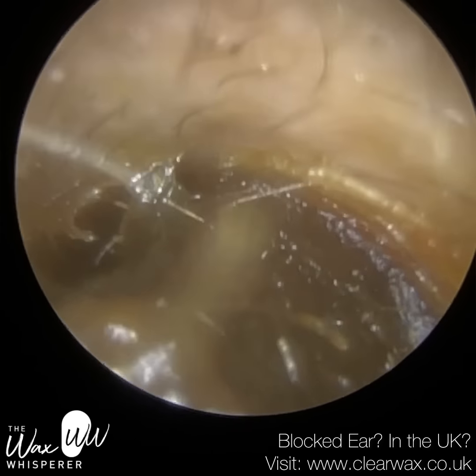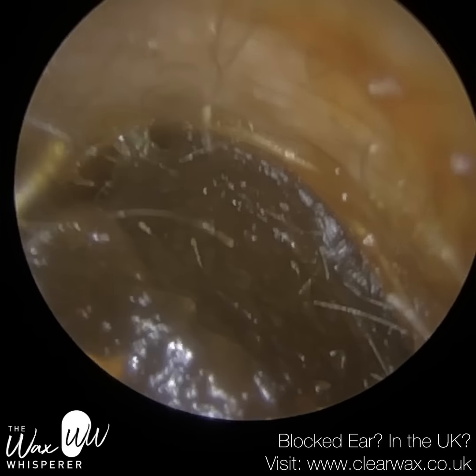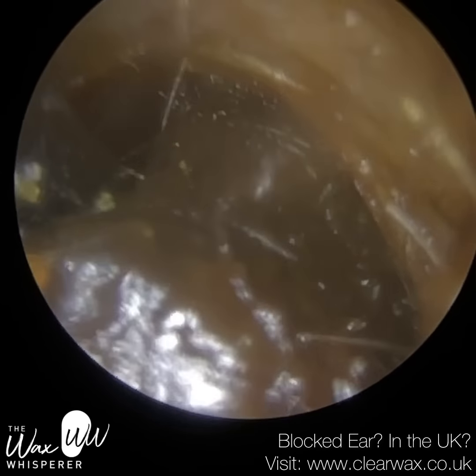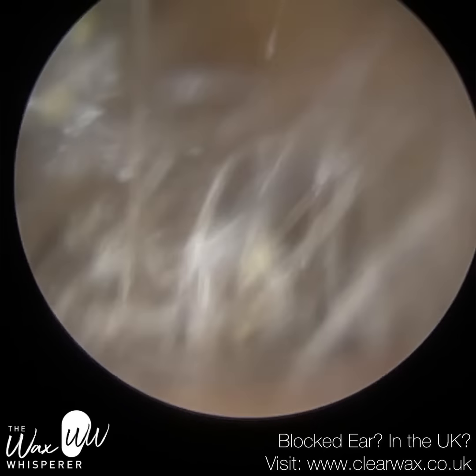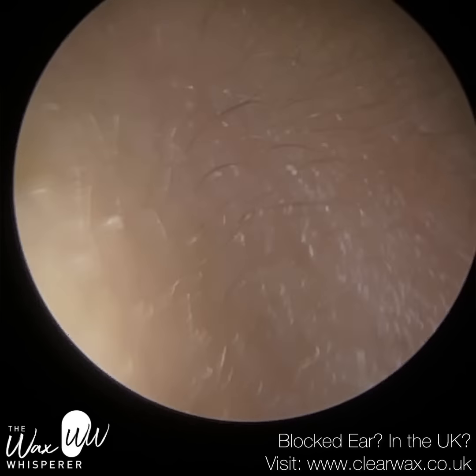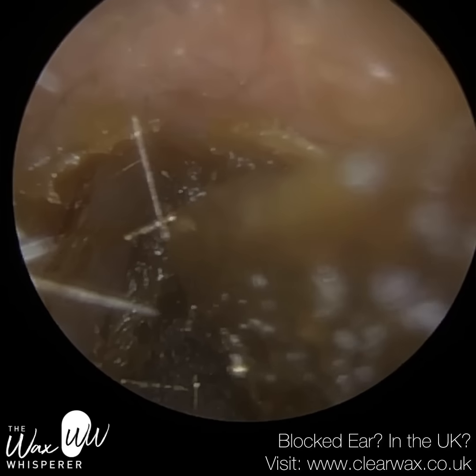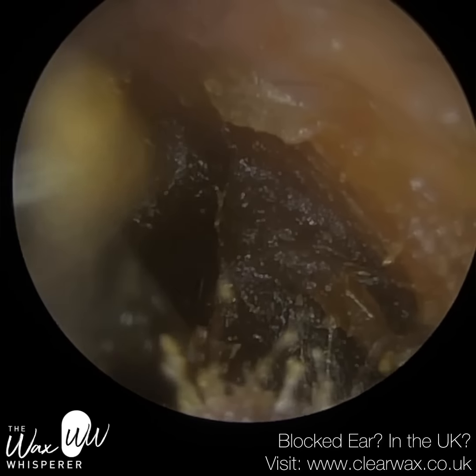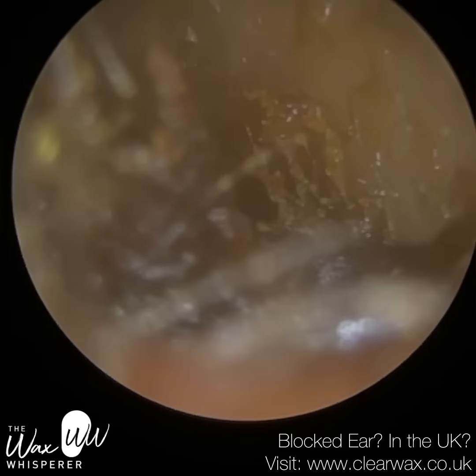We're now moving on to the right side. Again they've got hairs protruding from the surface of the first bend of the ear canal, which is the cartilaginous portion — about one third of the canal. It's made up of cartilage at its base, and on top of that you've got a layer of skin with three distinct layers. The subcutaneous layer contains connective tissue and insulating fat.